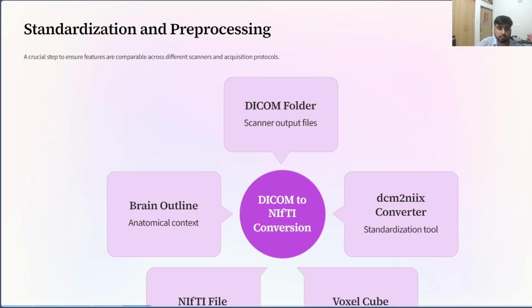After conversion, I verified both datasets. They originally come in DICOM format, thousands of 2D slices per study. To handle them uniformly, I used dcm2niix, an open source converter, to transform DICOM files into NIfTI files. Conversion was very important because NIfTI is an open format in which both can be easily processed and features can be extracted.